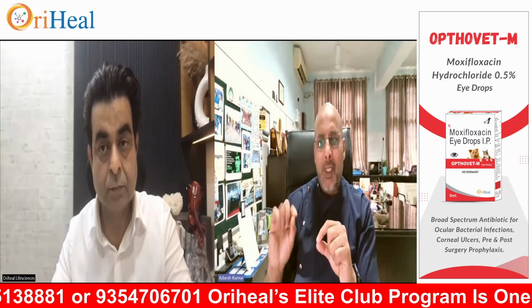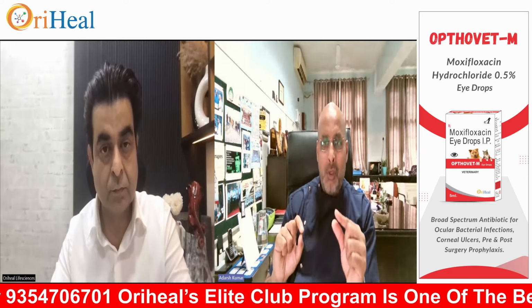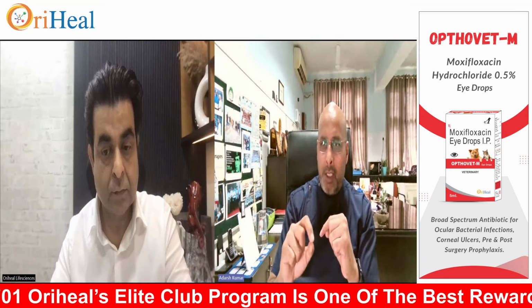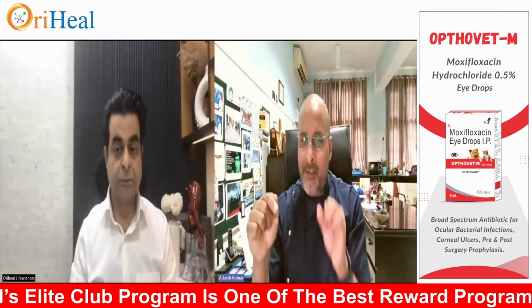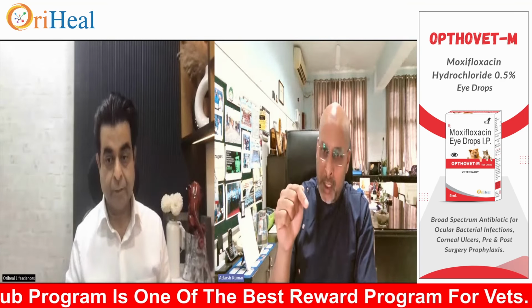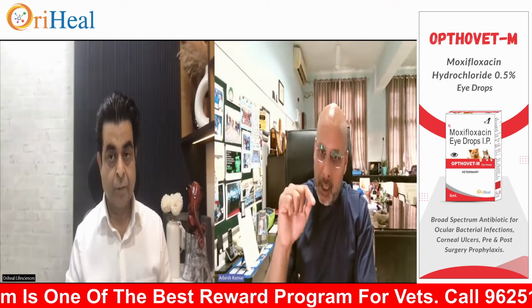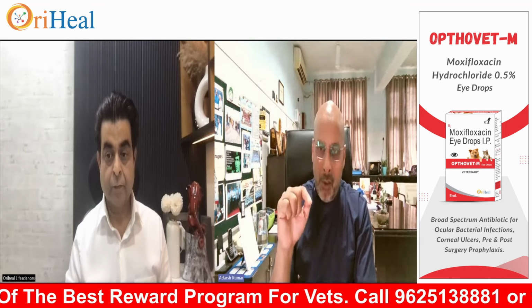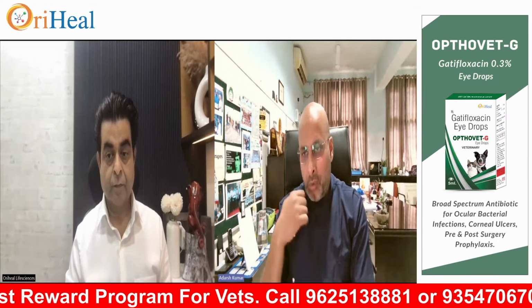But if some vital structure has been left inside and a sizable amount of the root is inside, dissect the alveolar, cut the alveolar, and take it out. Or what I sometimes do, if I find a very small piece of tissue remaining inside, I put a round burr inside and give it a rotation, and I try to shave off the internal cavity of the alveolar. Along with that, scoop the tissue out.